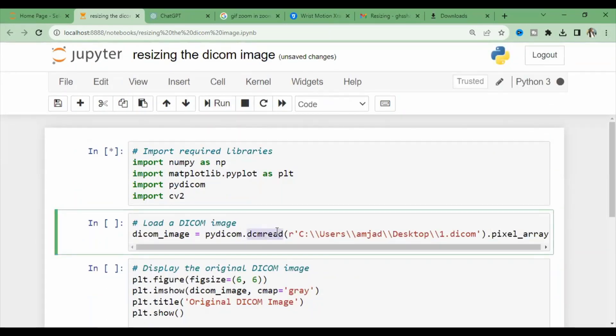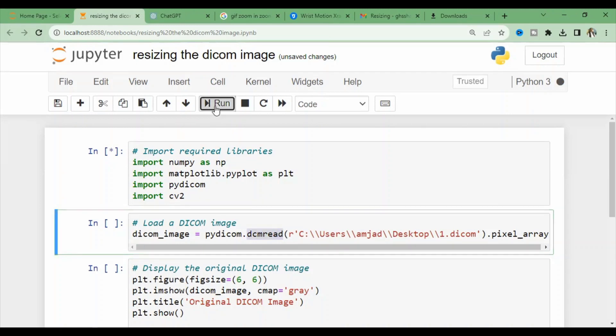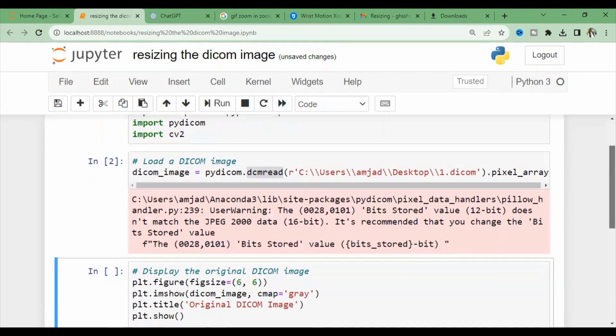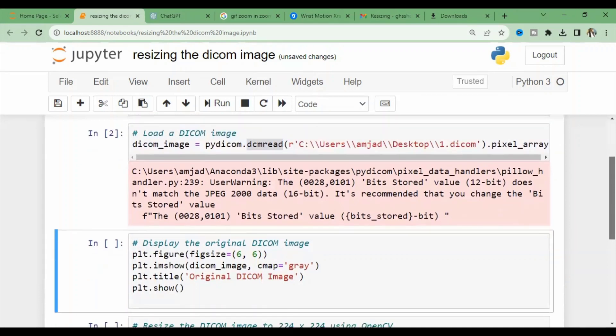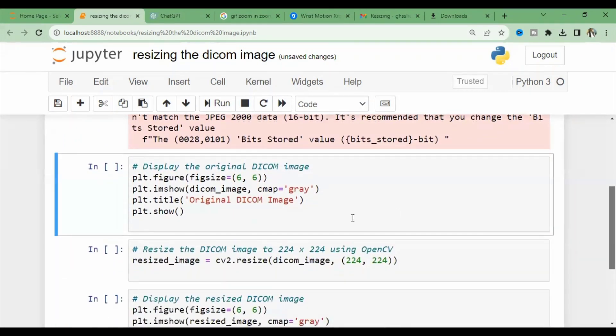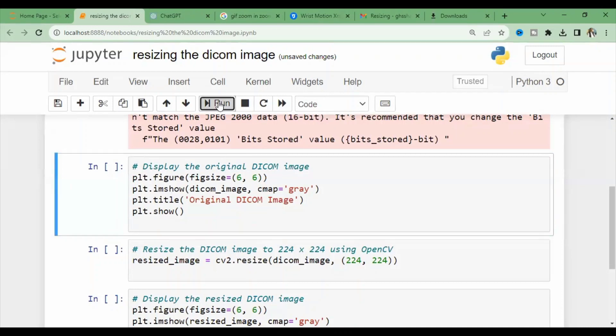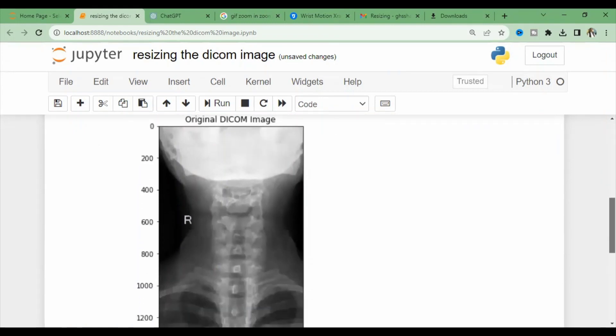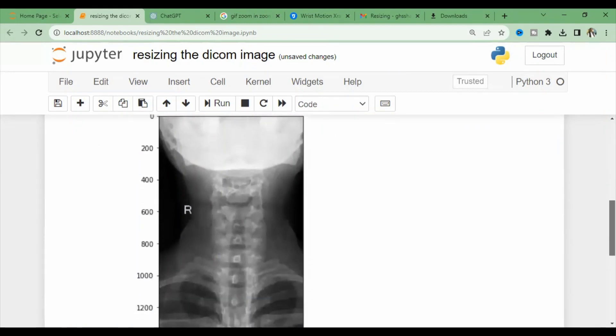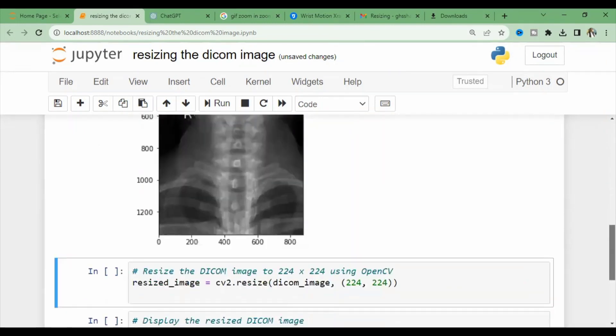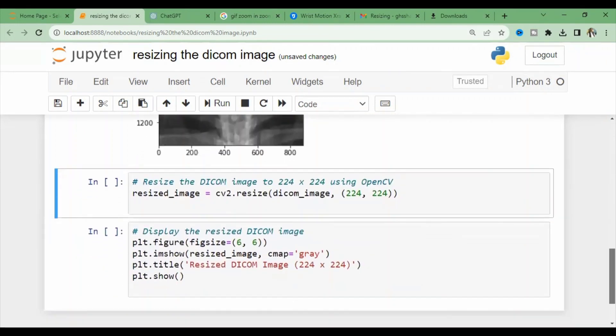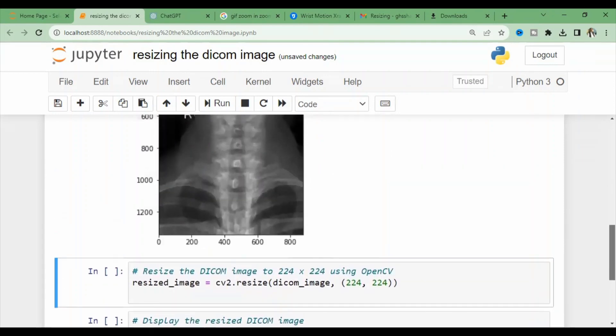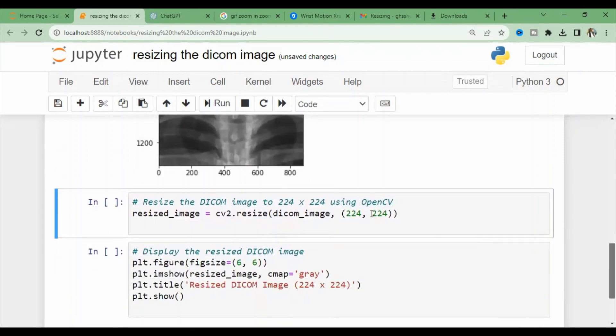You can ensure that you have the exact path of the image here and display it. Next, we display the original DICOM image here in front of you. I compile this code and here you can see the original image that we are going to resize, or redimension.